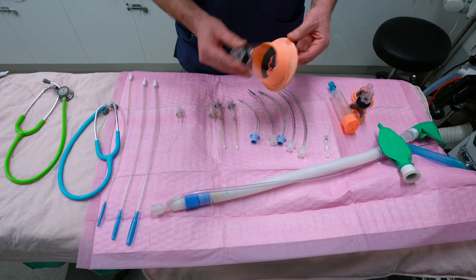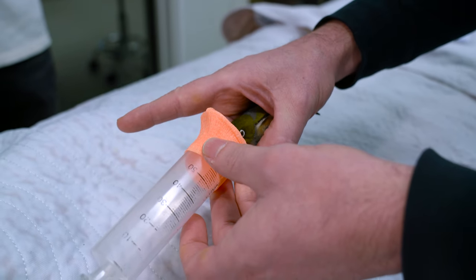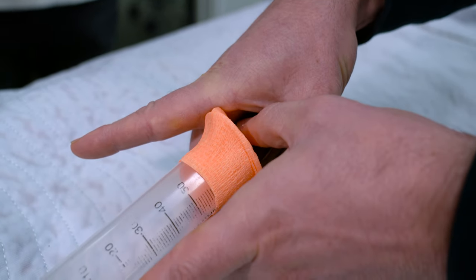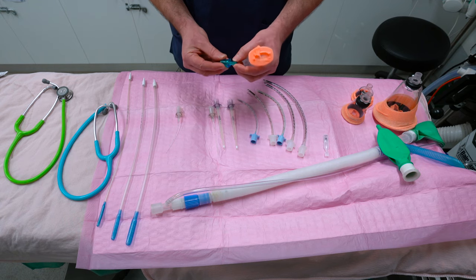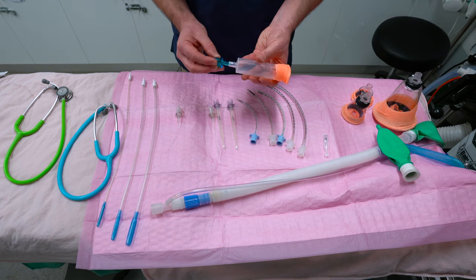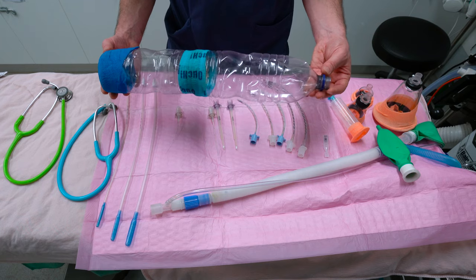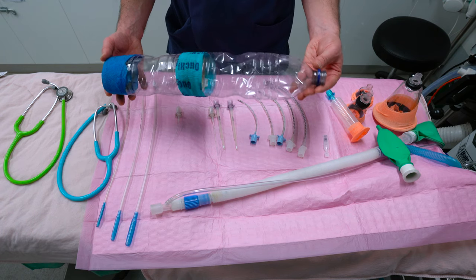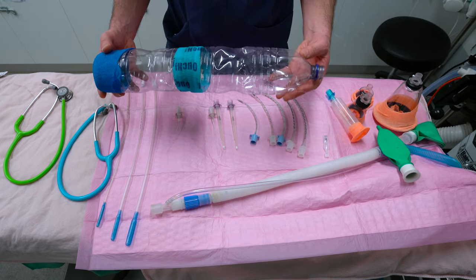Use a bag of an appropriate size for the bird — for very small birds, use the smallest bag you can. We have commercial masks but we can also make masks with syringes, plastic bottles, or anything suitable for the species you are anesthetizing. You just need a small piece to connect the syringe to the anesthetic machine. We once made a mask using two plastic bottles to anesthetize a pelican — a large bird with a big beak. As long as it's an appropriate size, you can just make one as you go.